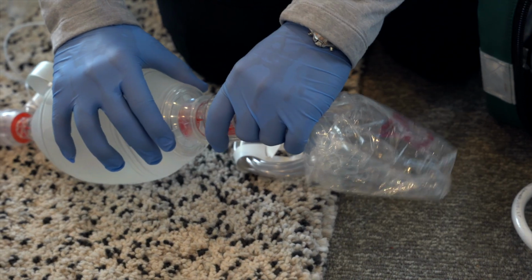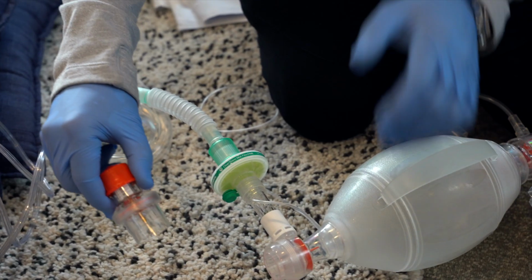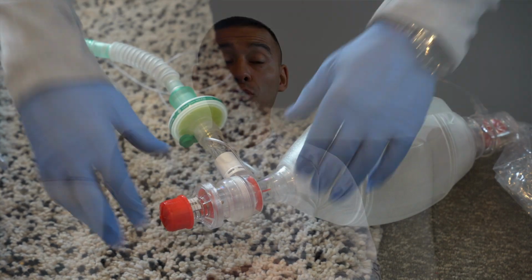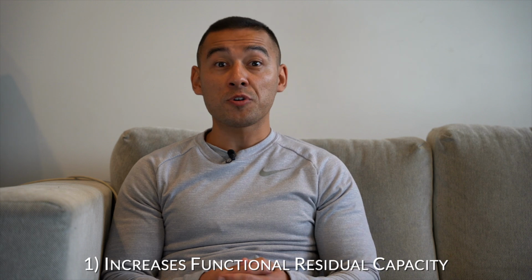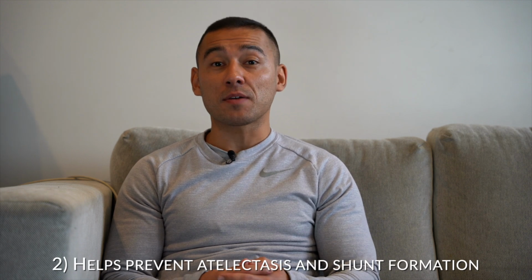It is important to note that the device will entrain room air if the patient's minute volume exceeds the reservoir capacity. Therefore, at least 15 litres a minute of oxygen should be applied. A PEEP valve should also be attached and start at 5 cm of H2O. Positive end expiratory pressure, or PEEP, is important when pre-oxygenating the patient for the following reasons. Firstly, PEEP increases functional residual capacity and therefore maximizes the oxygen storage capacity of the lungs. Secondly, PEEP helps prevent atelectasis and shunt formation.